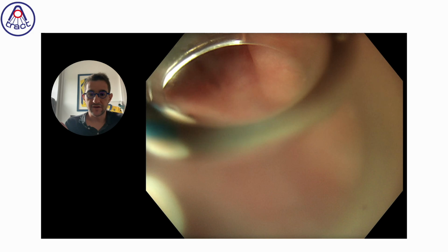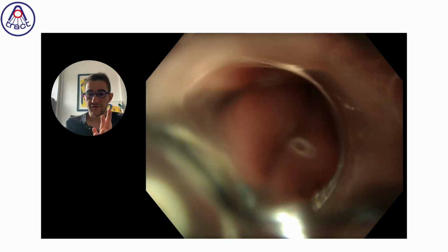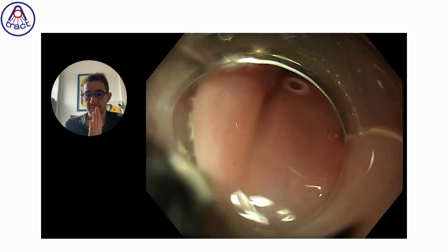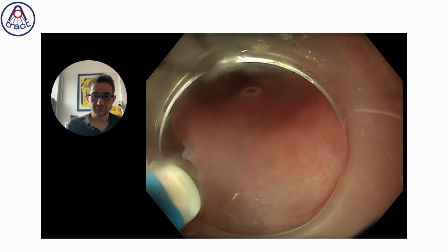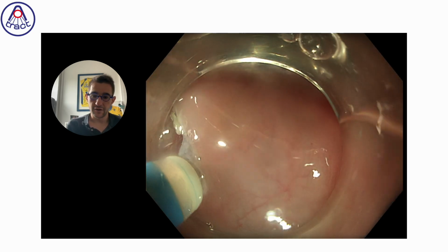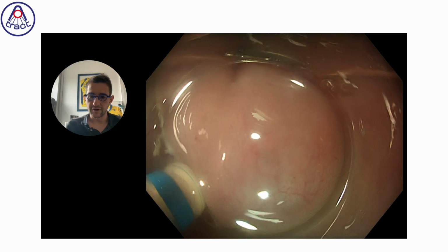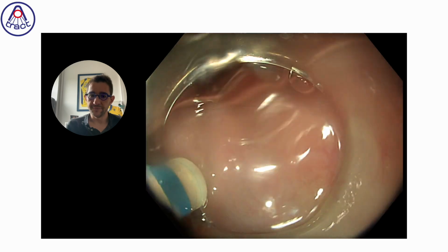It is the same in ESD. If you want to work precisely, you should be fixed on something. It means making a contact with the cap on the table. So here we are still with one of our fellows. I don't remember exactly if I take again the end or not, but we will see.